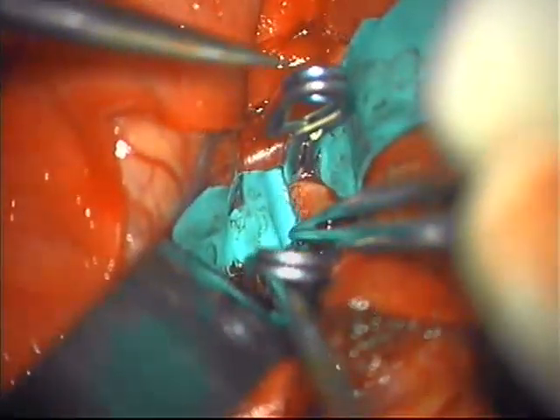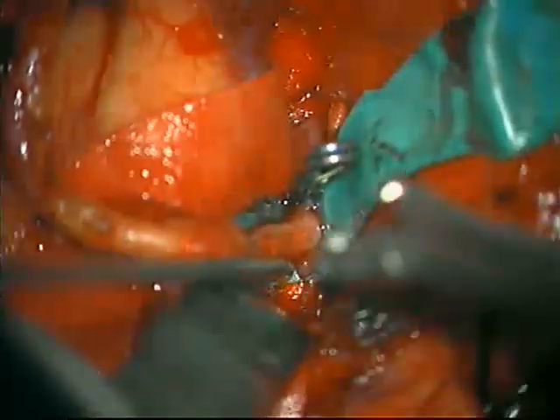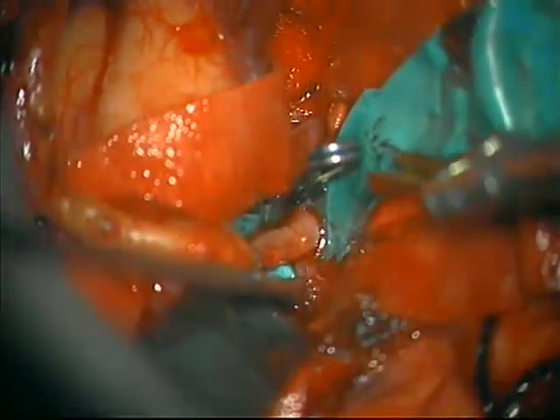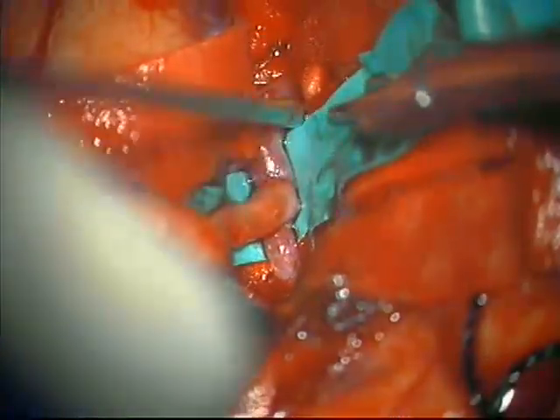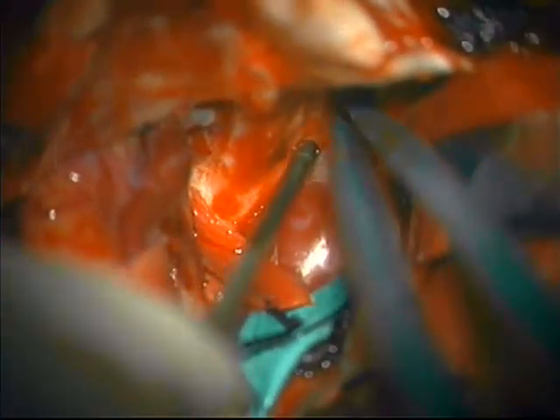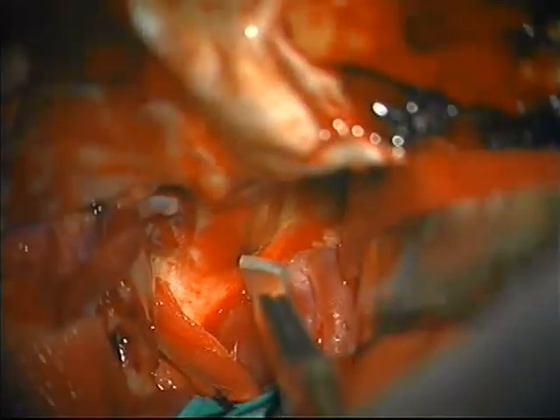After the anastomosis is finished, the proximal and distal temporary clips are removed and the functioning of the bypass is confirmed. After the bypass, we come back to the aneurysm area to coagulate, cut and separate the dura over the optic nerve and the anterior clinoid process.